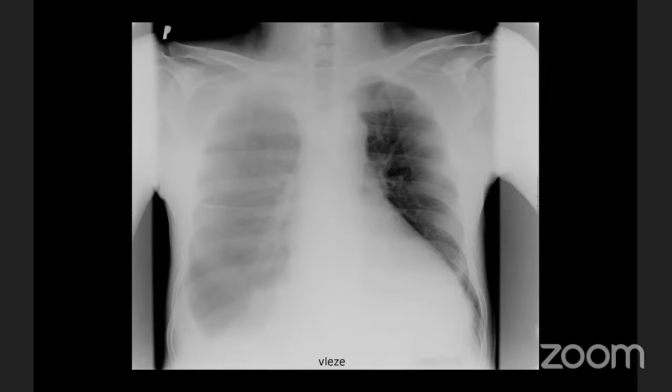So what do you think is the cause for the difference in translucencies? I would say maybe a severe effusion, like fluidothorax. Great. That was really great. Thank you very much. Definitely. You can see how it's whiter.